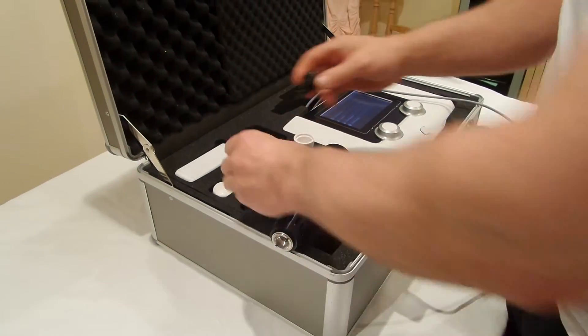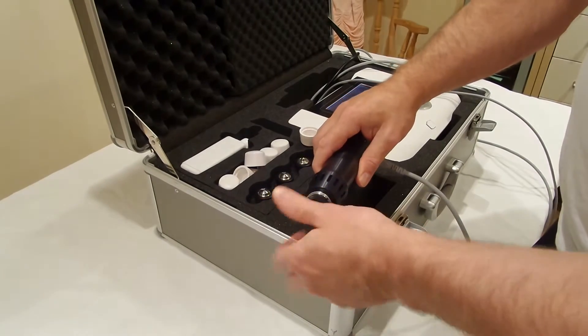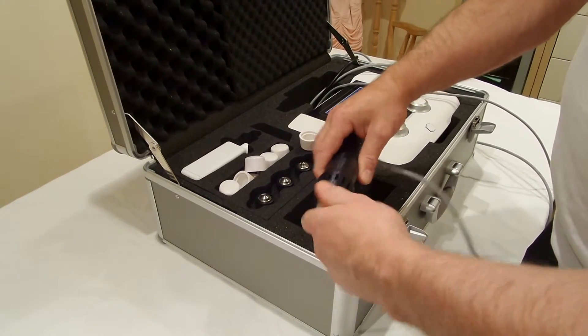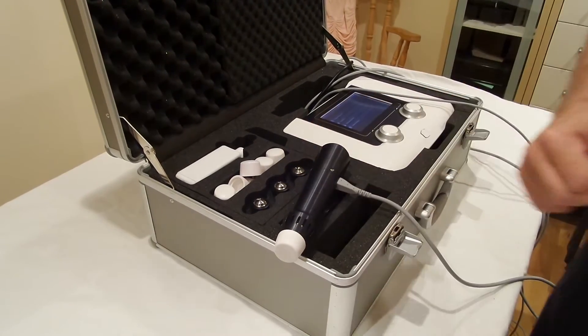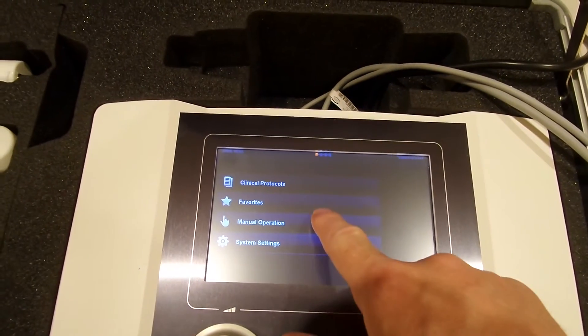We're going to start by applying the larger head to the shockwave machine. This is a 30mm head rather than the 15mm head that we might use for a smaller area. Unscrew the head, screw the new one into place, put back on the rubber coating and we're now ready to go on to the settings.